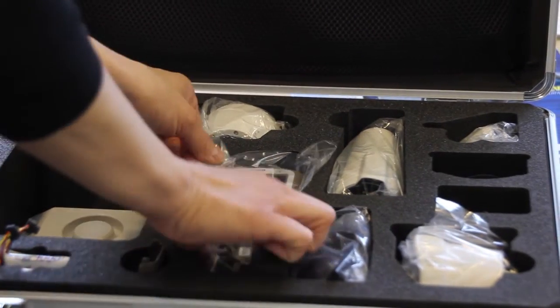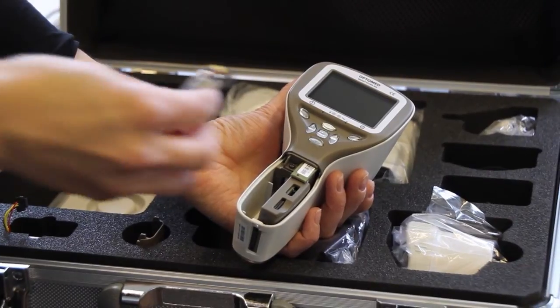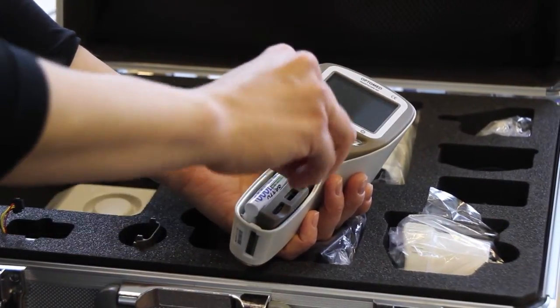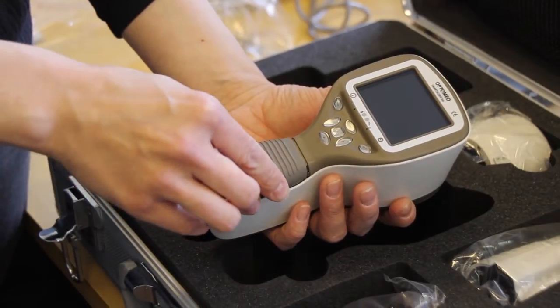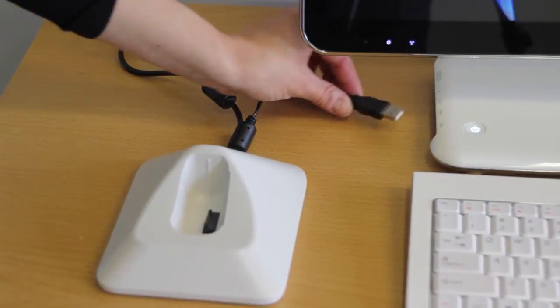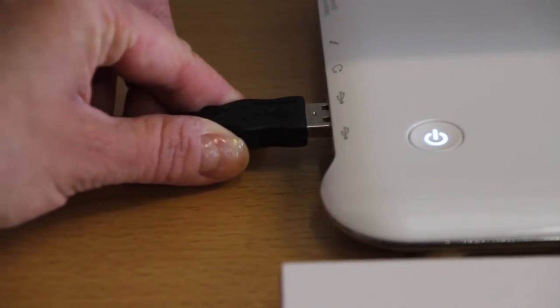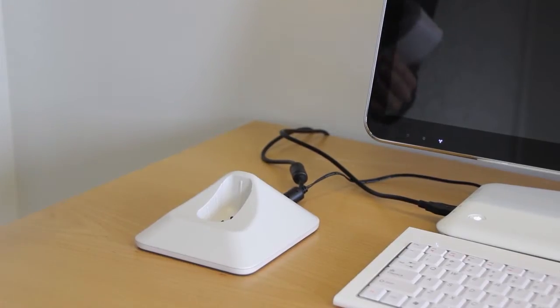Initial setup. Before first use, remove the device from packaging and check that all parts are undamaged. Insert the battery into the camera and close the battery compartment cover. Place the cradle next to a computer and attach the USB cable to connect to a power source. Then place the camera gently in the cradle.